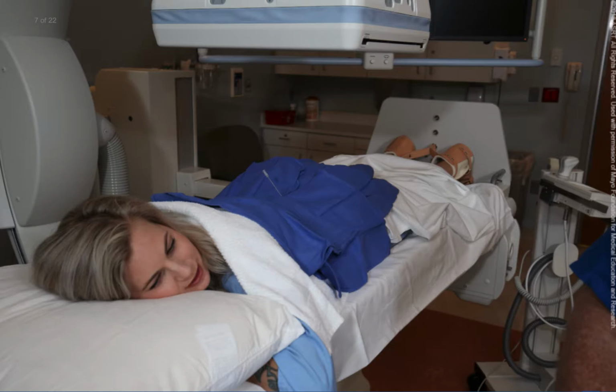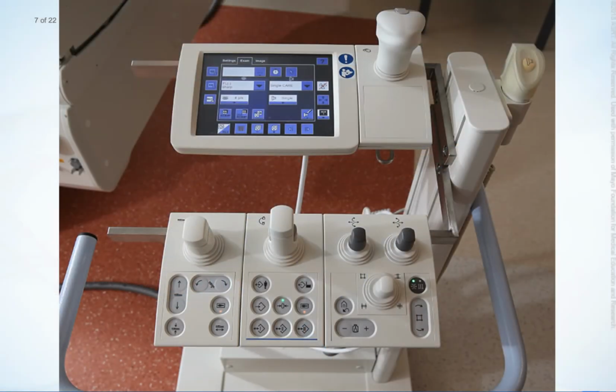Automatic dose rate controls and automatic brightness controls automatically adjust the kilovoltage peak, or kVp, and milliamperage, or mA, to achieve a dose as low as reasonably achievable. Selecting the correct patient procedure and patient size on the fluoroscope will ensure the kVp and mA settings will be appropriate for the procedure being performed.